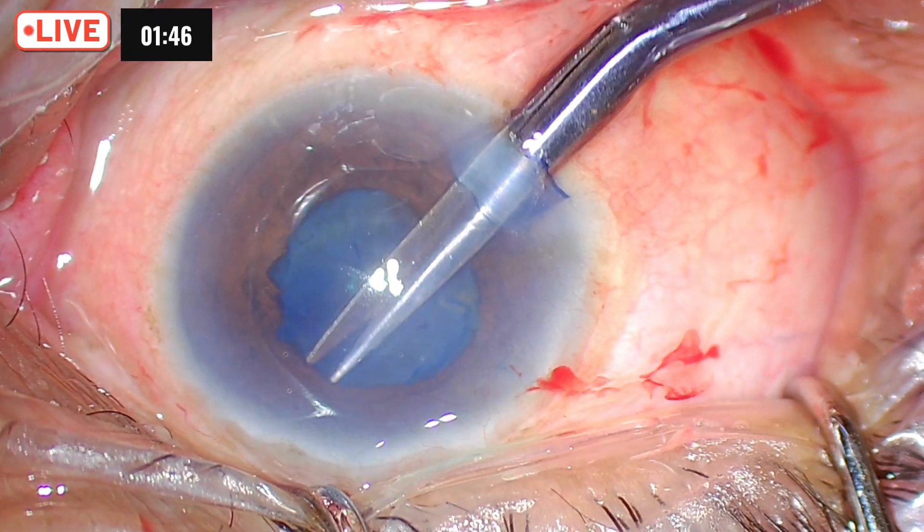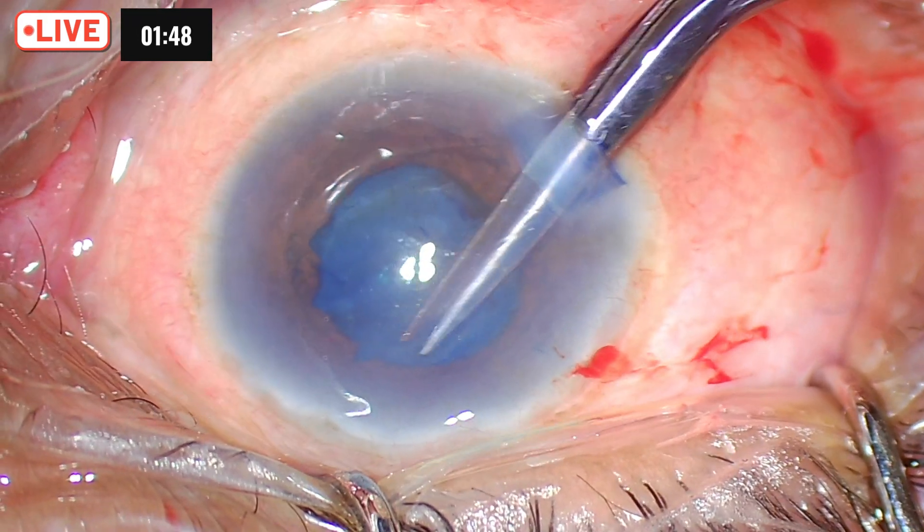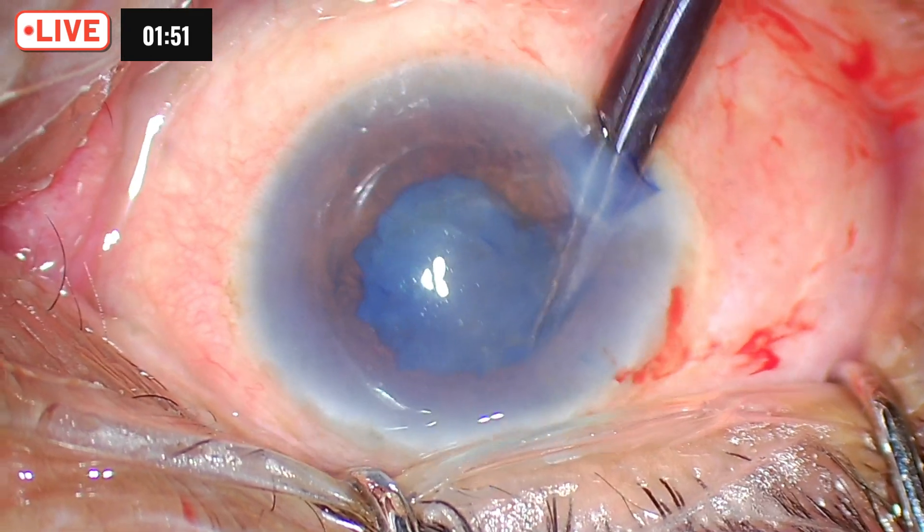You can see the zonules are also compromised because of pseudo exfoliation — you can see the whole capsular bag moving.